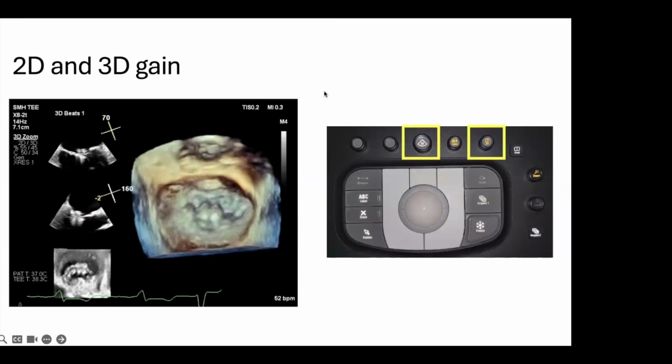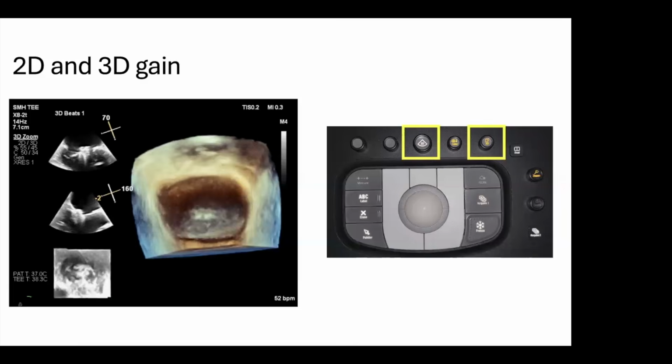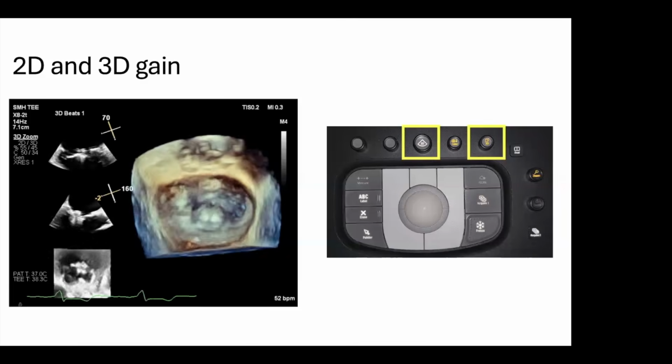2D and 3D gain are worth talking about as well. This is another important part of actually being able to present your image properly.